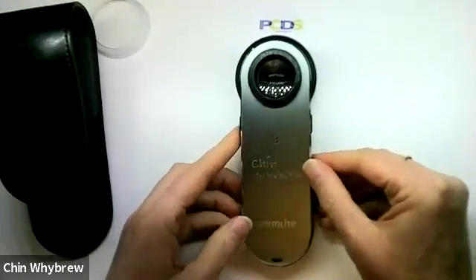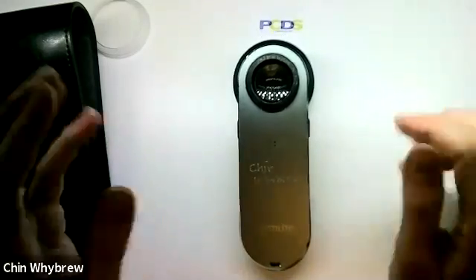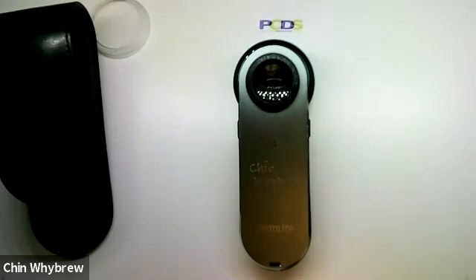So that is the DermLite DL3. I'm just showing you the equipment — to learn how to use it and for more details about interpreting what you see, please do come along to one of our dermoscopy training sessions. You can see which ones are coming up by looking at the PCDS website: PCDS.org.uk.